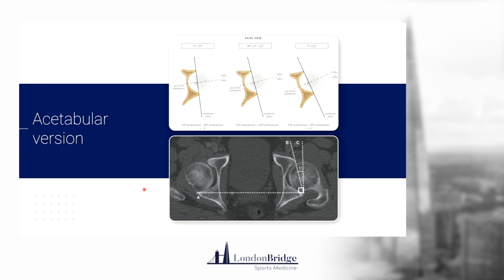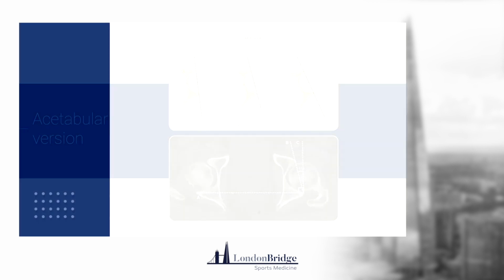You can look up and say, okay, what are the acetabular angles doing? What's the femoral neck angle doing? What's the femoral shaft angle doing? And if you go far down enough, you can say, okay, what's the tibial angle doing? So if you're someone who's very pernickety about the acetabular versions or the versions of the lower limb, you're going to need a CT scan. That's more useful for the orthopedic guys when they're doing their preoperative planning, but for SEM doctors, I think it's quite useful for giving you a fuller biomechanical picture.